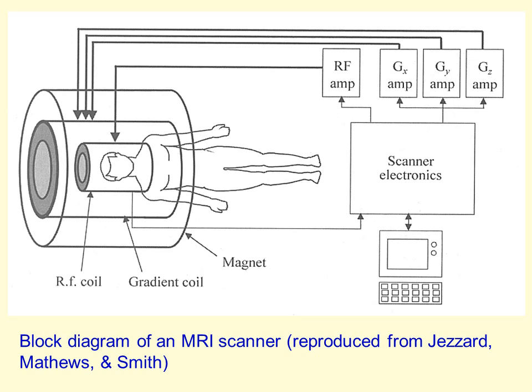This image is a block diagram of an MRI scanner. An MRI scanner has 3 main components, and in this section of the lecture we're just going to have a quick tour of how each of those three main components contributes to ultimately making the value of image intensity that you have at each voxel of the image, as we saw on the previous slides.